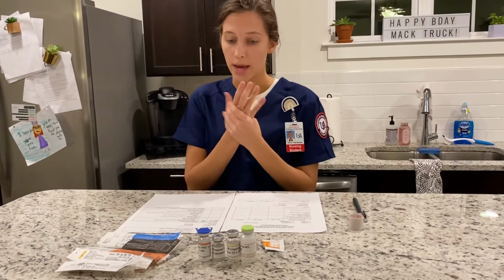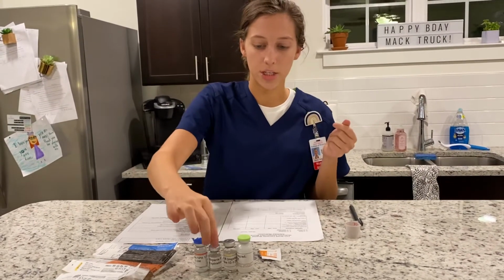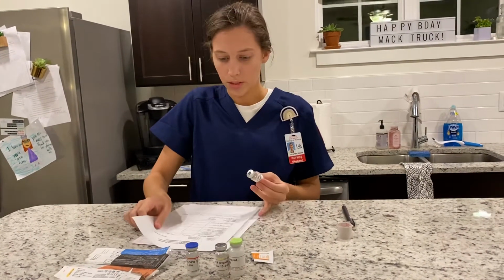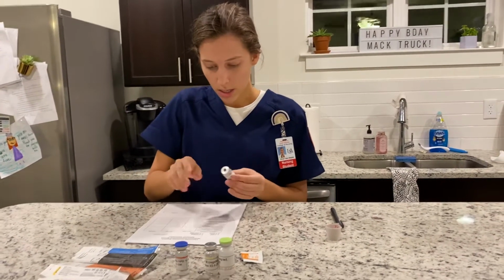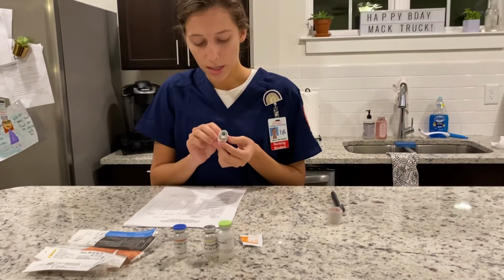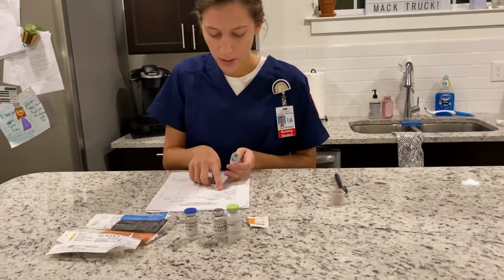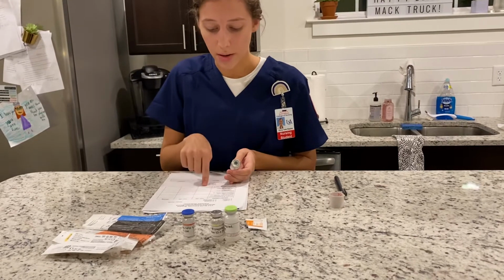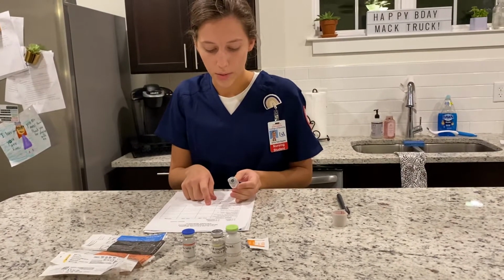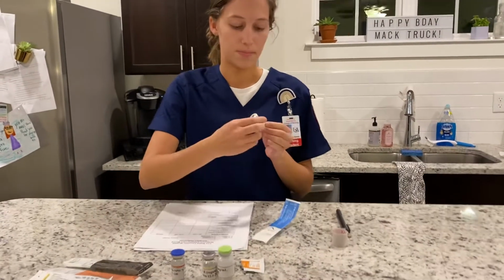So now I'm going to perform hand hygiene, and I will select the correct medication, which is heparin. And I'm going to check this with the MAR sheet. So he's given heparin. I noticed that the drug is not expired, it expires in 2025. It's supposed to be given every 12 hours. It has not been given in 12 hours, so that's why we're going to be administering it now. And it is given subcutaneously, so I'm going to be using the TB syringe.